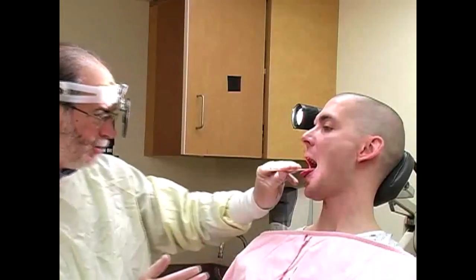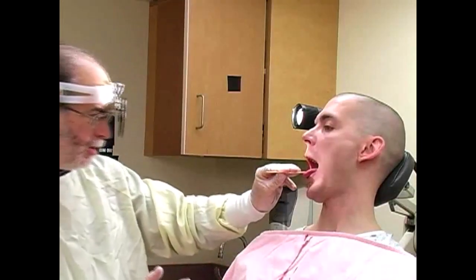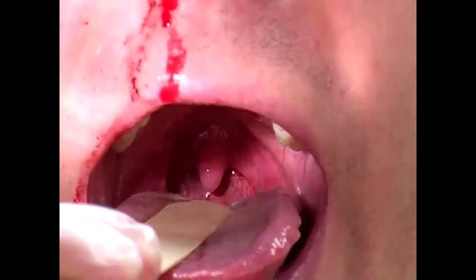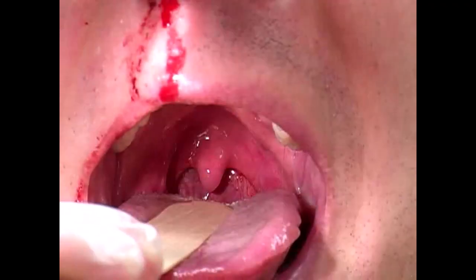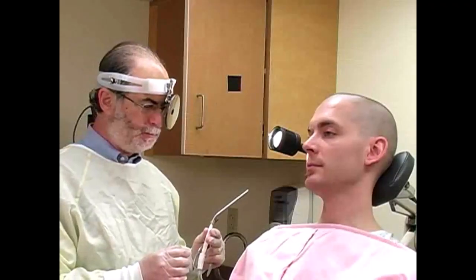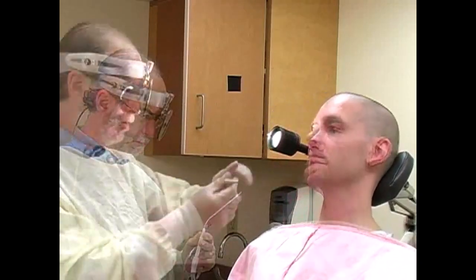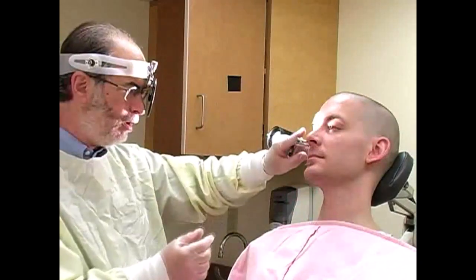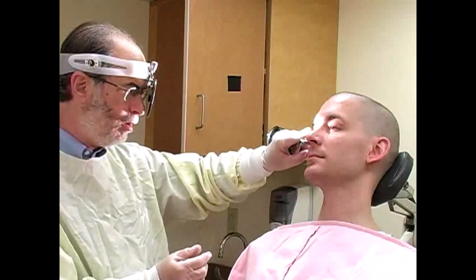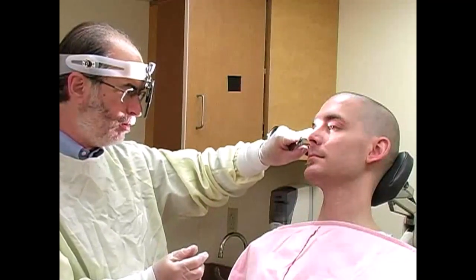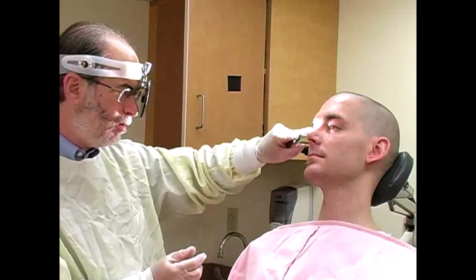Check the posterior oropharynx for blood coming down from the nasal passageways. Instruct the patient to gently blow his nose to clear away any clots or blood. Then use a nasal speculum to evaluate the anterior nasal canal.